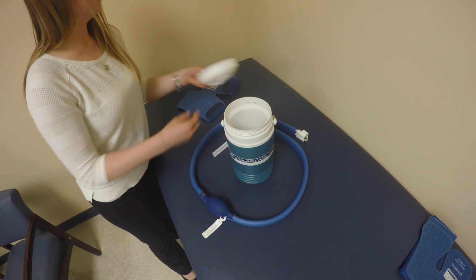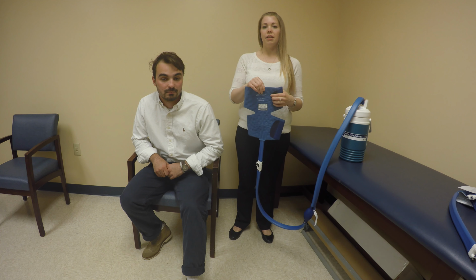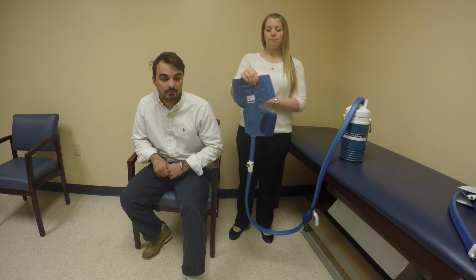When you're ready to use your wrap, you should first place a barrier on your skin. That way the wrap is not directly on your skin. You can then detach both straps from the pad and place over the knee. You'll then pull both straps around until it is snug and secure.